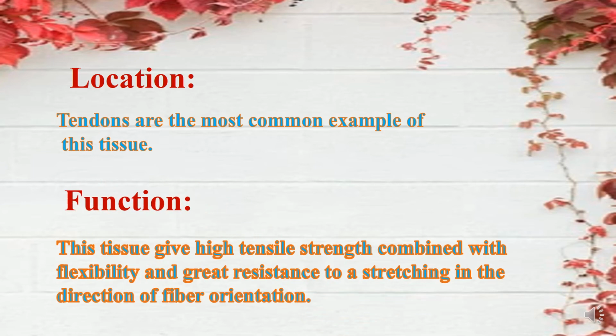The function of dense regular connective tissue. This tissue gives high tensile strength combined with flexibility and great resistance to stretching in the direction of fiber orientation. إذن يعطي مرونة وقوة جدا عالية ومقاومة باتجاه القوة اللي يتعرض إليها الفايبرز.